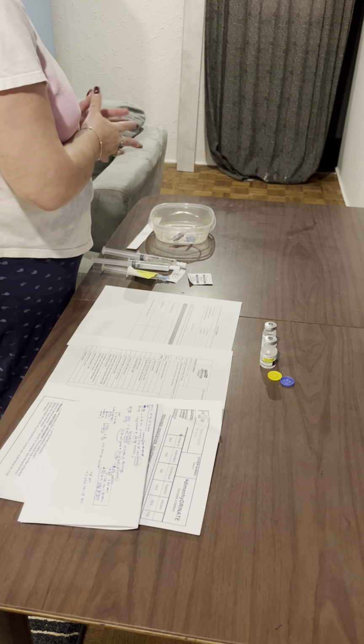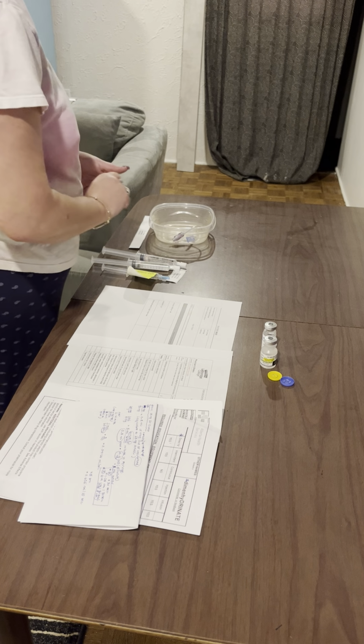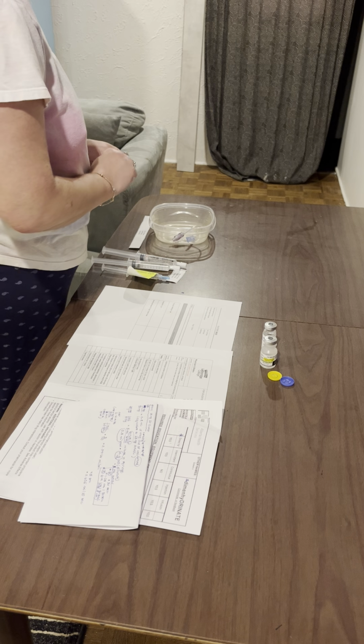And the first thing we're going to do is we're going to flush this to ensure that the site is patent. And I also want to tell you, Mr. Lab, that when I'm flushing, you shouldn't feel any pain or any coldness or see any swelling or anything at the site at all. So just let me know when we flush this, and hopefully that will not happen.